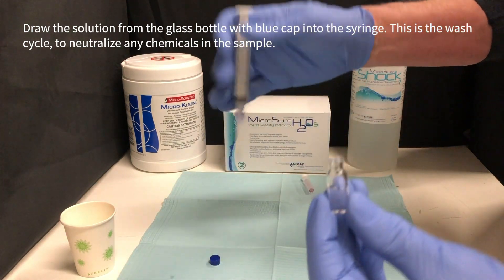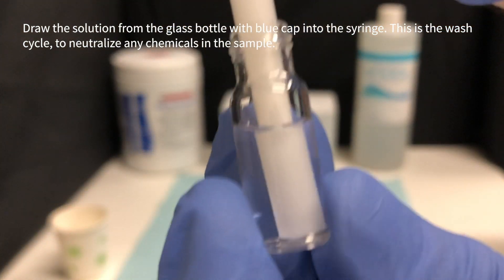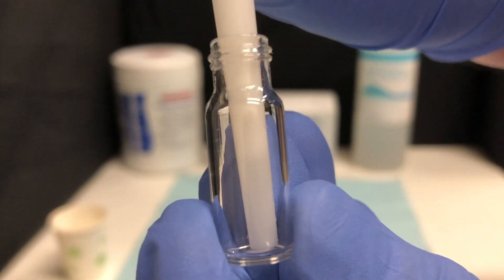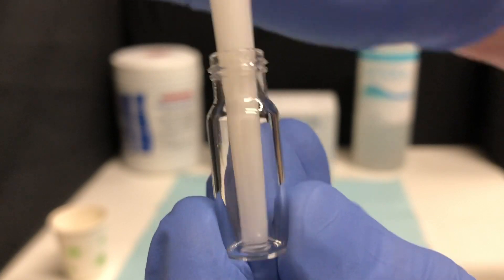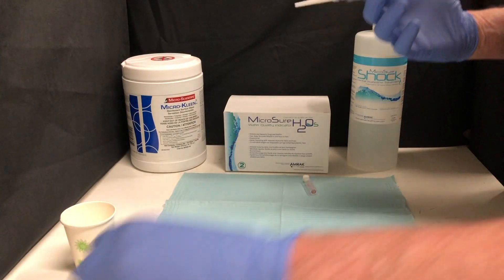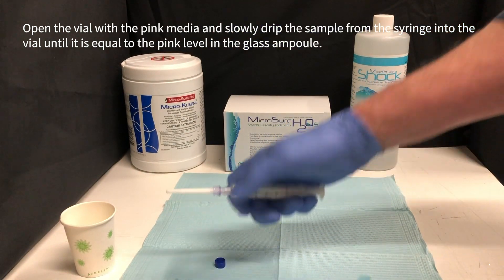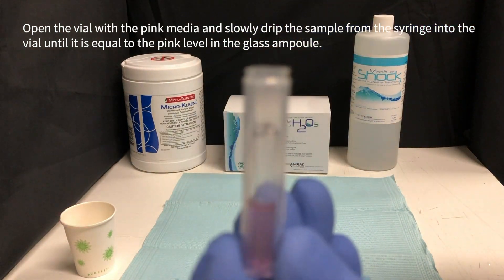Draw the solution from the glass bottle with the blue cap into the syringe. This is the wash cycle to neutralize any chemicals in the sample. Then open the vial with the pink media and slowly drip the sample from the syringe into the vial.